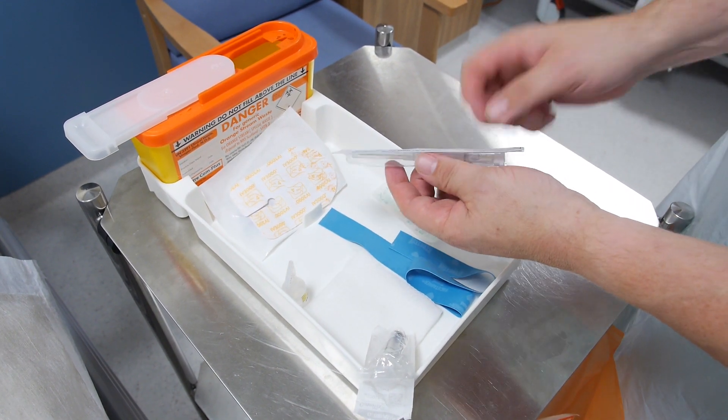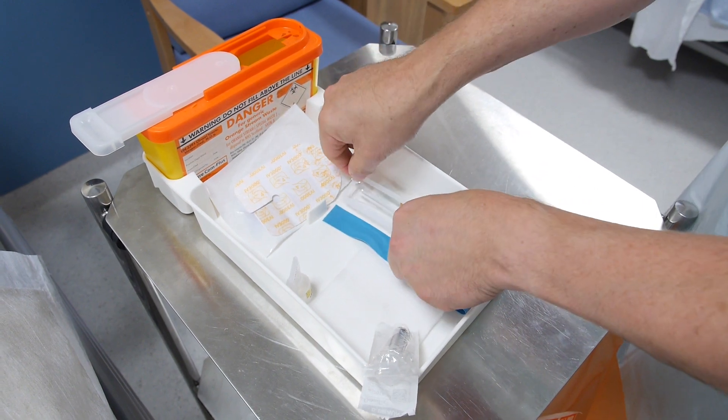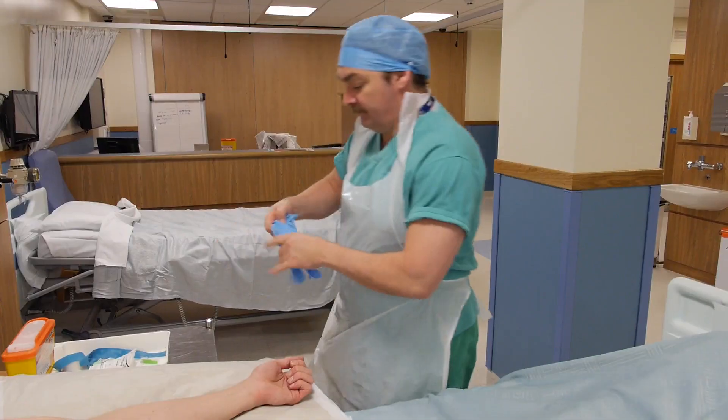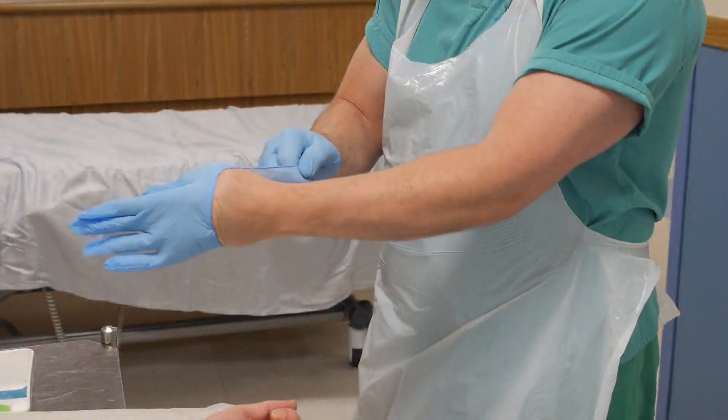Ensure you have the correct size of cannula for the patient's age, the reason for insertion and their condition. Prior to cannula insertion, don a pair of well-fitting gloves.